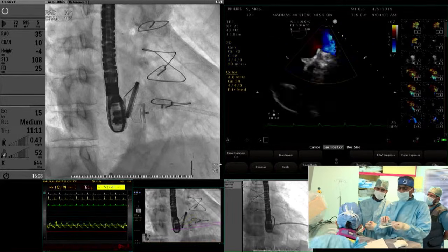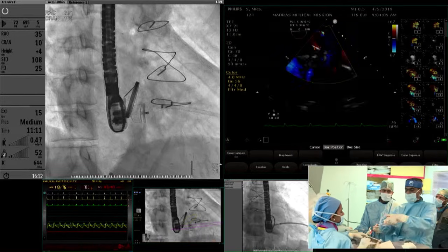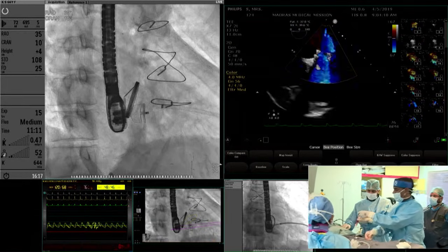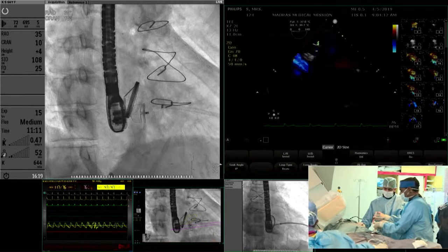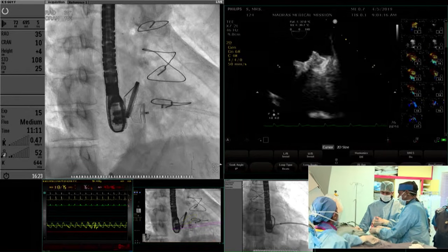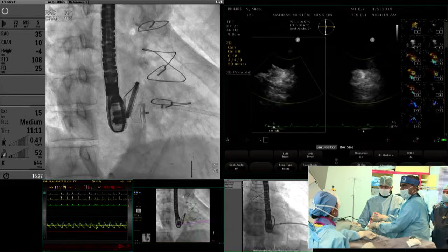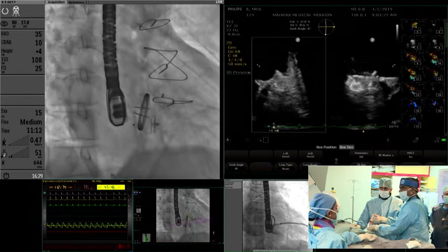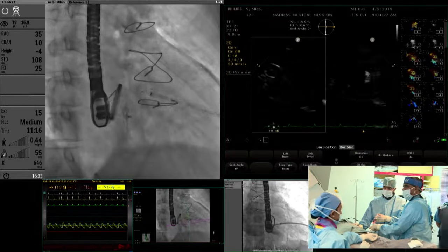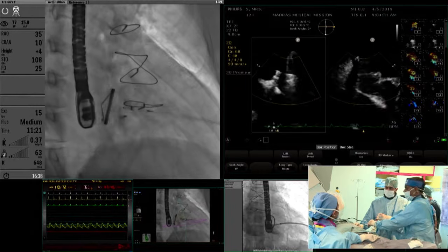Now I'll tell you one of my experiences about using a vascular plug versus a duct occluder. The advantage of a duct occluder is that it has got a fabric, and so we feel that the chances of closure are far better. But one of the problems is the wires are pretty stiff, and so it splints the hole, and some of these leaks tend to persist for a little longer.